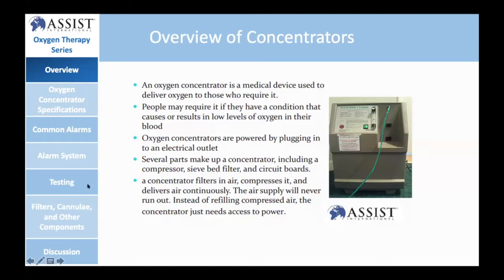There are of course a couple of technologies to do that. To separate a mixed gas, an oxygen concentrator uses pressure swing adsorption, which I will come to later for a more detailed discussion. But in short, an oxygen concentrator is an electrically powered device, and it's very portable. You can move it from one room to another, and you can use it at home also. So it's the most common and preferred oxygen delivery system in low and middle income countries in general.